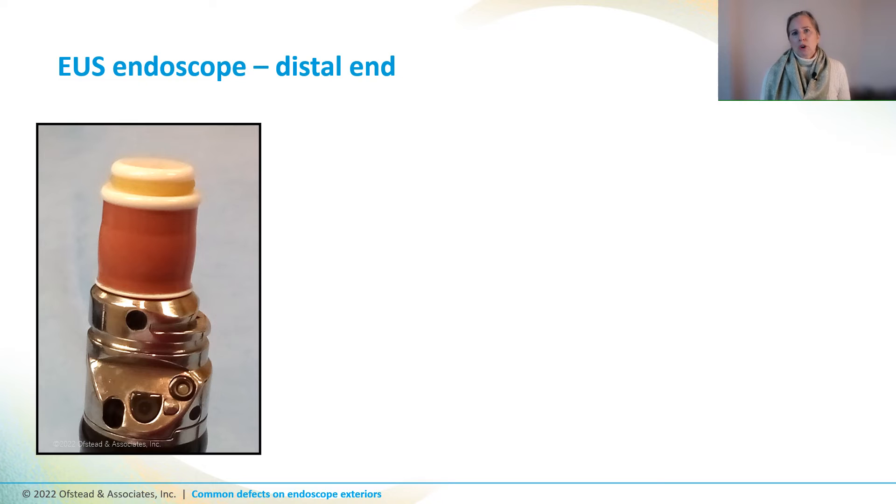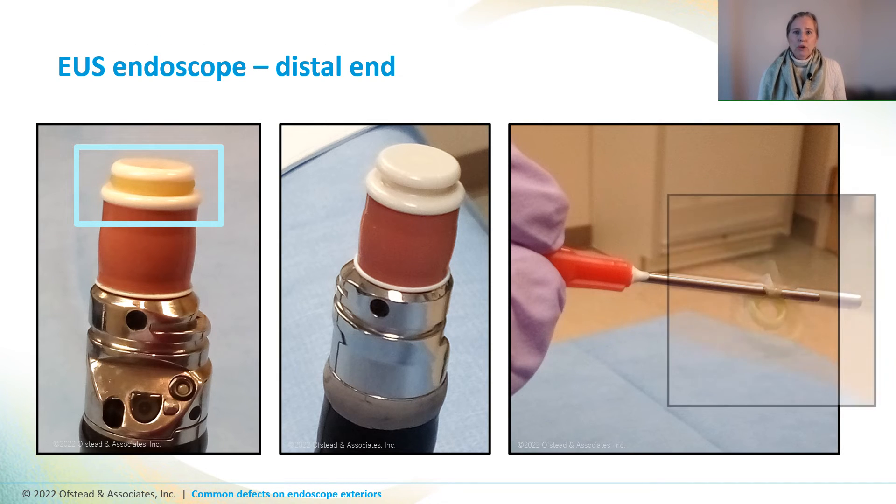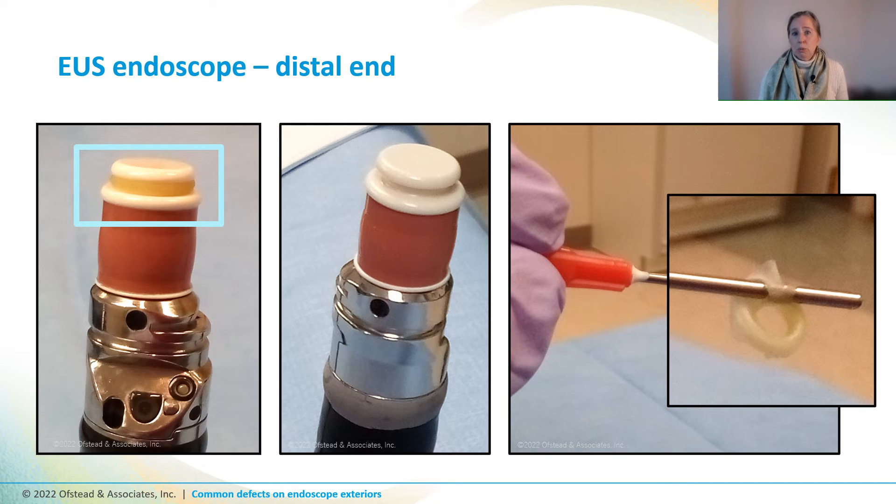This is the distal end of an EUS scope that has a pink ultrasound component, and I noticed something yellow in the groove that holds the balloon in place during procedures. When we pulled out a photo taken previously of this same scope, there was nothing yellow in that groove. The techs used a little instrument to try to grab it, and sure enough, part of the balloon didn't get removed by staff in the procedure room — and their processing techs didn't notice it either, because they weren't using a magnification system to inspect scopes and didn't know what to look for.